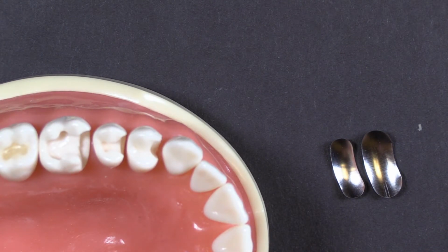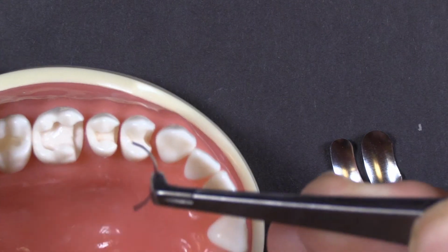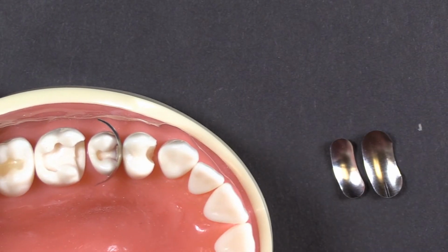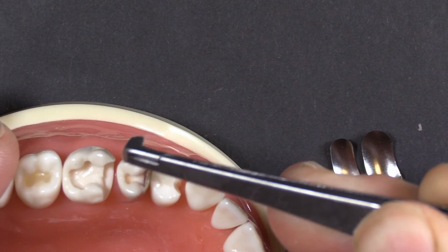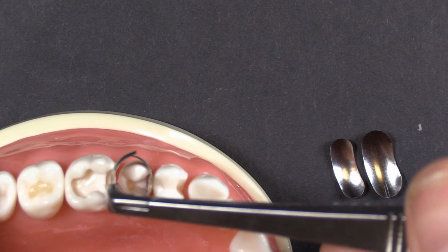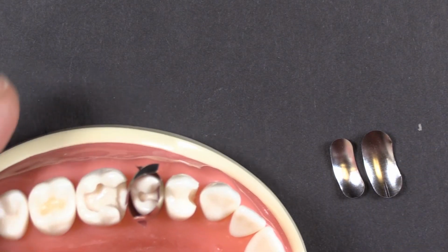So what I'm going to do here is I'm going to go ahead and, where did I put it? Here it is. I'm going to pretend that our little MO here is an MOD, and you can already see what we're looking at. You can see how far that band comes around the tooth. What you want to do is kind of help it out a little bit, push it out of the way, squash it against the buccal and lingual side of the tooth. And again, we're pretending this is an MOD, and then you see how that can overlap there.